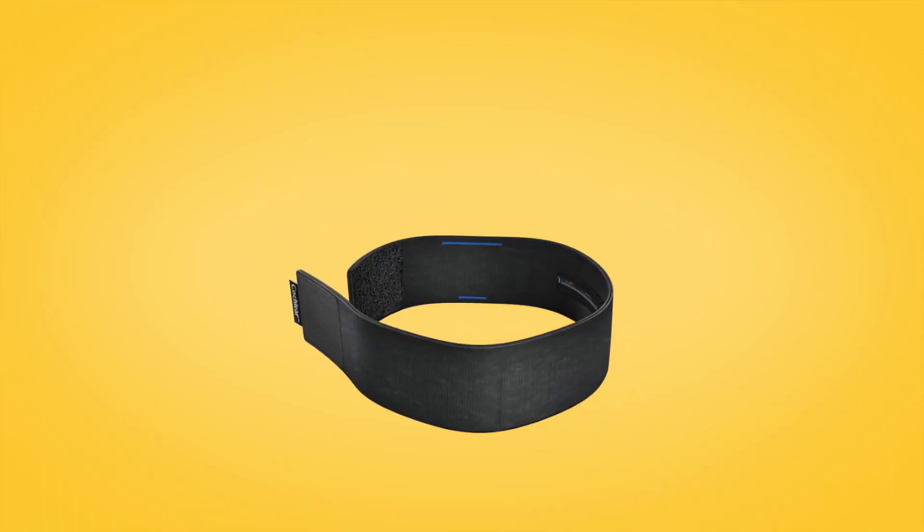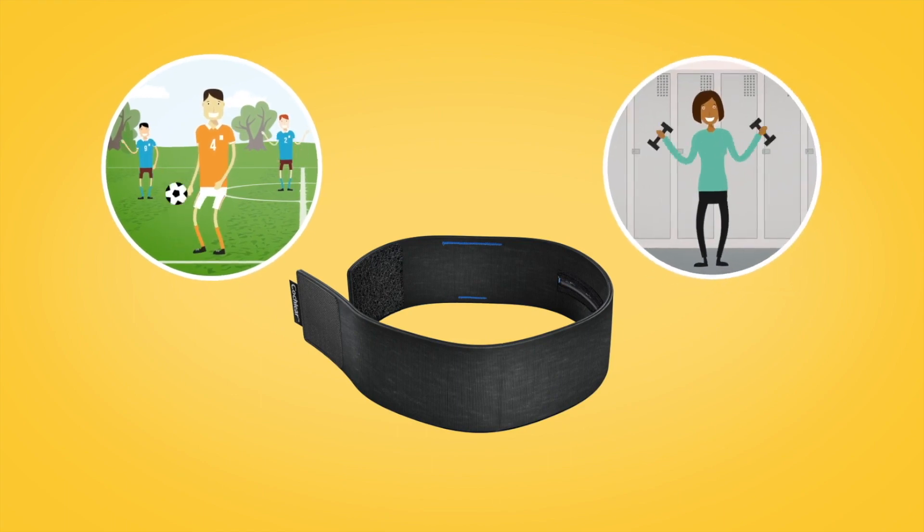The Cochlear Kanso 2 headband can be used to help hold your sound processor in place when you or your child are playing sport or exercising.